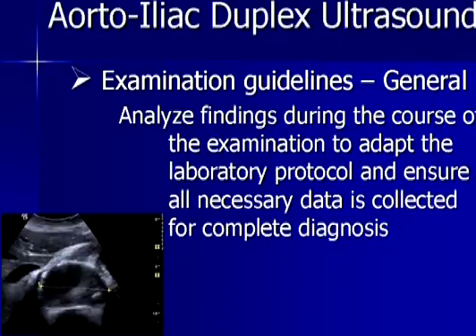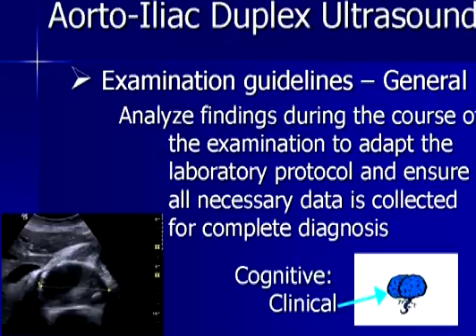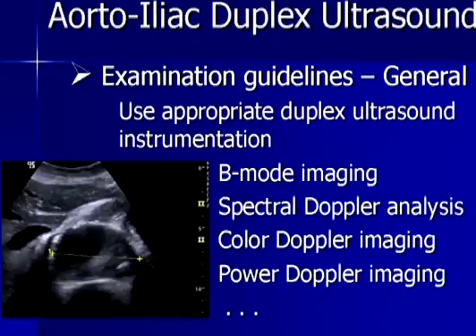At the same time, you want to keep your clinical skills sharp during the course of the study and analyze all of your data as you go, in case you do need to adapt your standard laboratory protocol to include additional information so that you're certain that all the necessary data is acquired for a complete diagnosis. This is your clinical cognitive skills. This is your right brain at work during the course of the study. So you can see that your brain is not going to get any rest during this study. You're going to include both lobes throughout the course of the study and be concentrating fully on the patient at hand.